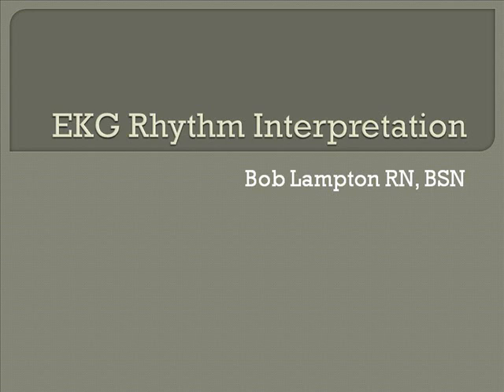I am a nurse. I have been a nurse for 10 years. Most of that time I've been a progressive care unit nurse, also sometimes called the telemetry unit. I'm making this video as part of an education project I'm doing for Sihanouk Hospital in Phnom Penh, Cambodia. This is an educational tool I'm using for this nonprofit organization to help educate the nurses on basic EKG interpretation.